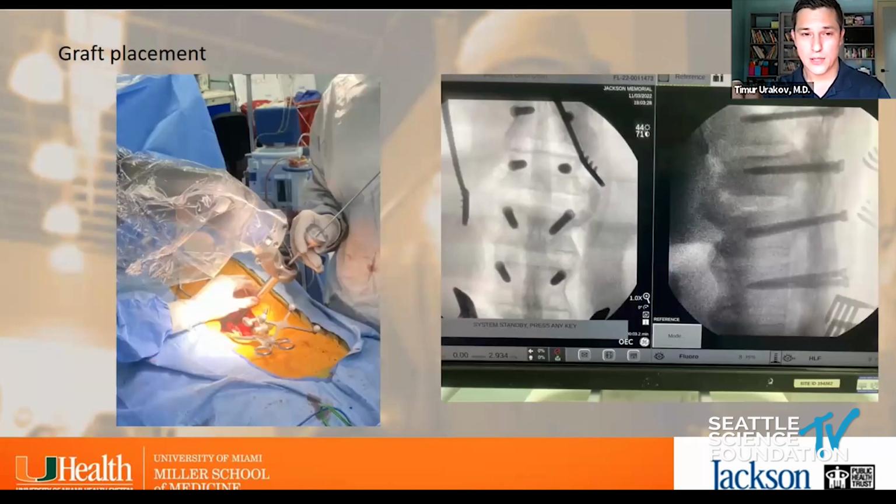And you can see how it looks intraoperatively. And I'm using the same steps as I would for the pedicle screw, using the drill, the reamer, getting into that space. And now I have a clear channel and I can put that funnel down and fill it up with the bone graft or biologics. And you can see on the right how that disc space is grayed out, especially more on the lateral, how I'm able to fill that space up.